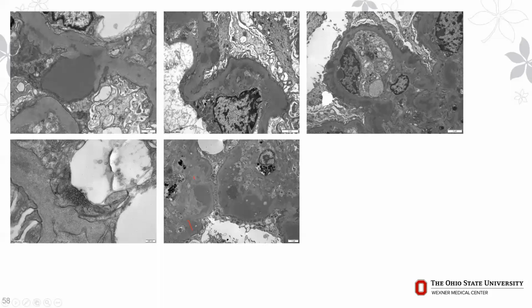And I don't think she had any bacterial infection. Viral infection could be some upper respiratory tract infection or something, which may even have triggered this. I don't know, it's hard to prove. But it's taking an upward turn again. I mean, it's not looking good. Again, we started to see endothelial tubular reticular inclusions. We had seen this in the very first biopsy in 2007, if you remember.